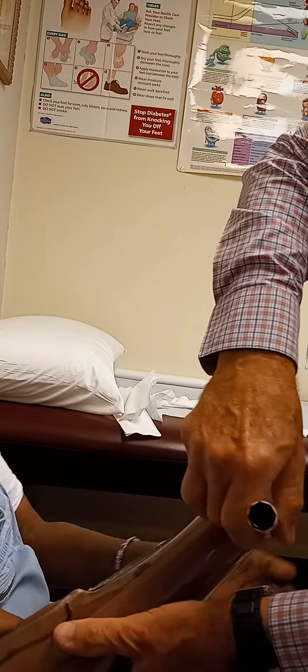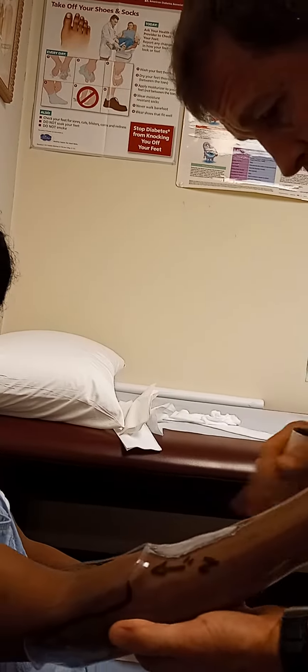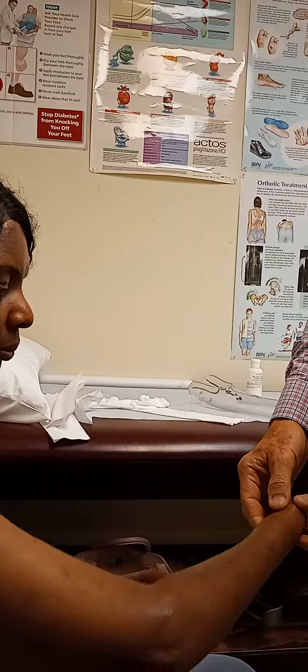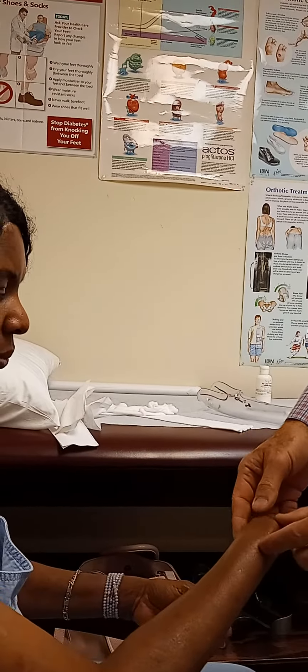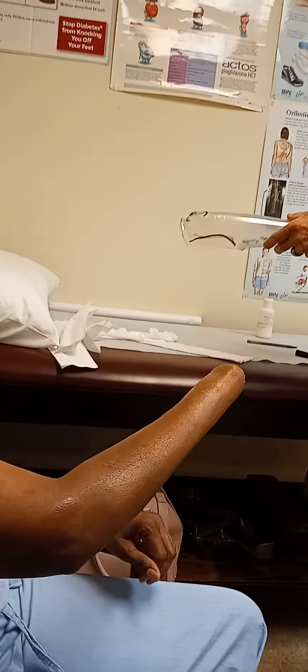Right here. Point with one finger where it is. Right there. I'm going to take it off your hair. Take a look at where that was hurting you then. Is it right here on the tip? Or is it more like over there? More right there. So it needs to be a little bit longer in the relief so I can see where I'm coming. We need to give you a little longer relief right there.